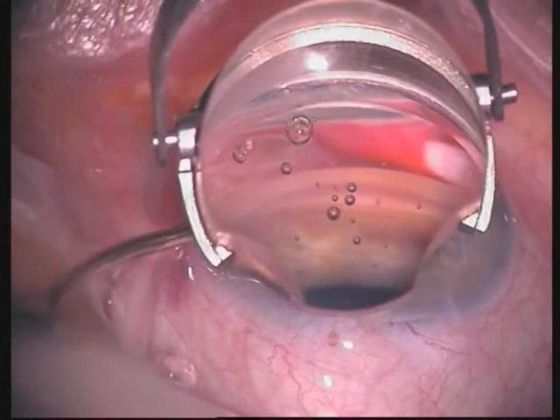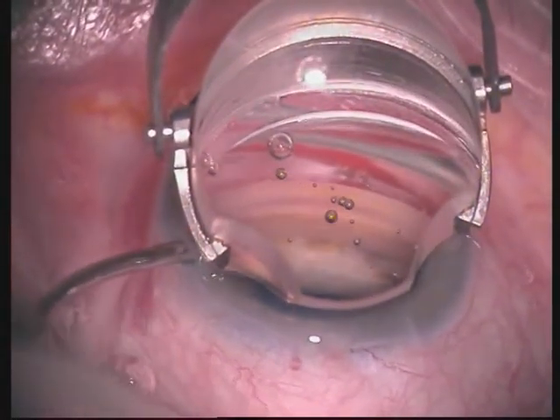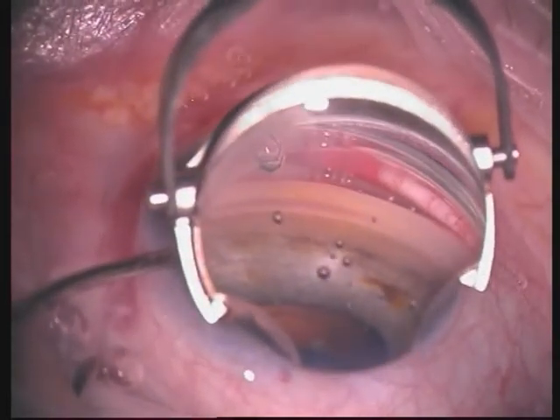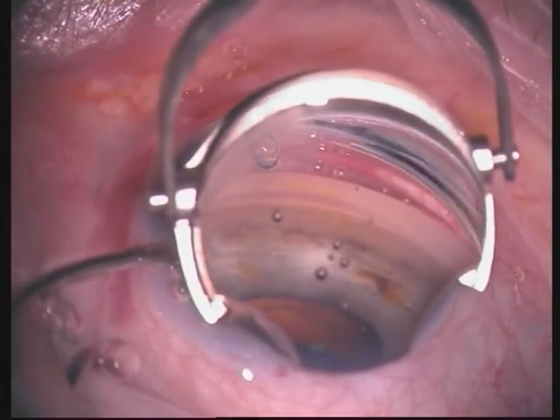After the focus of the angle viewing system is set, HPMC is placed on the cornea. The foot pedal of the microscope is used to center the lens and to zoom the image if needed.